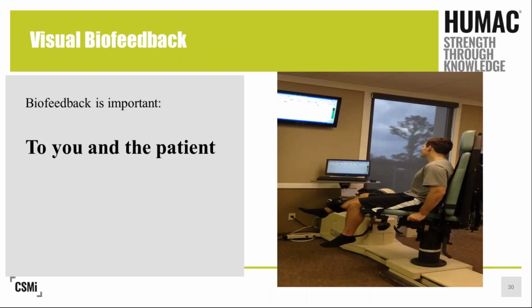And then how about visual feedback? Because I think this becomes really important to us, not only to you, but to the patient also. One of the things that you can see is that instead of just having the monitor, we actually mounted a large screen on the wall and tied it in together.